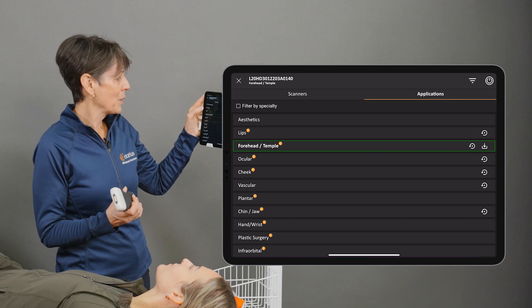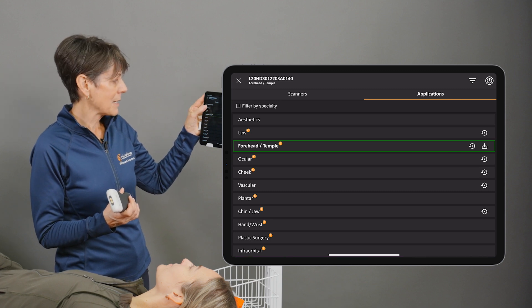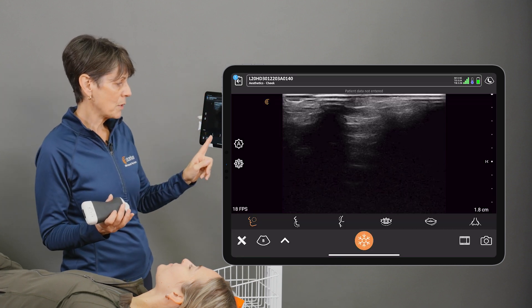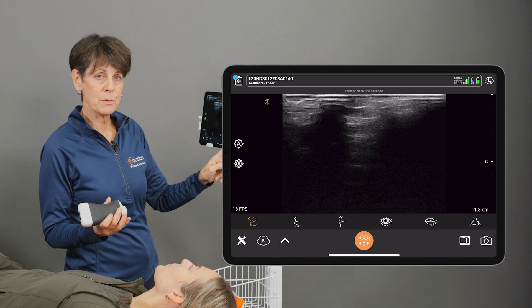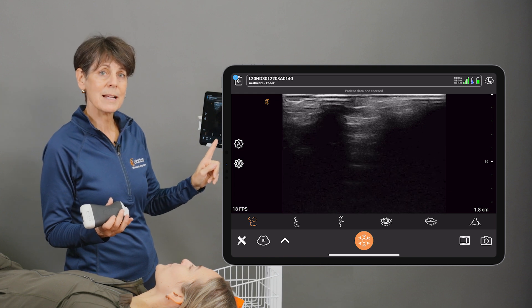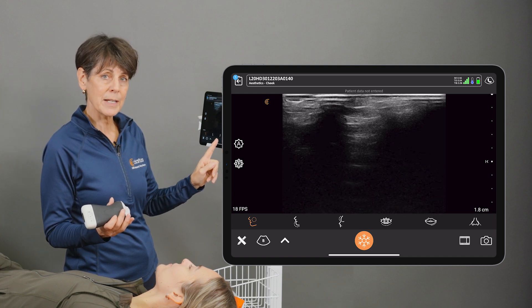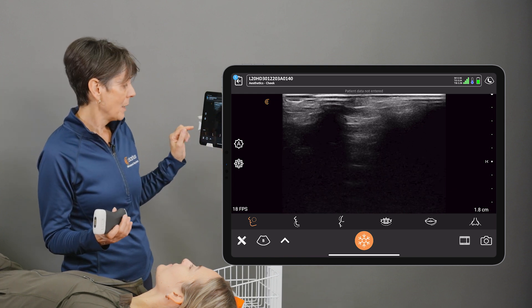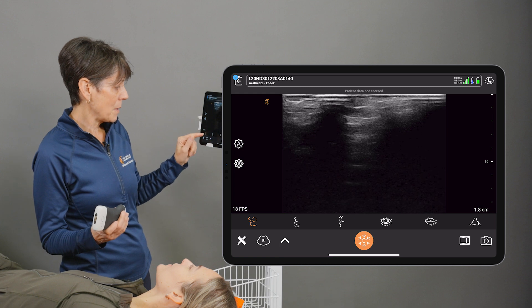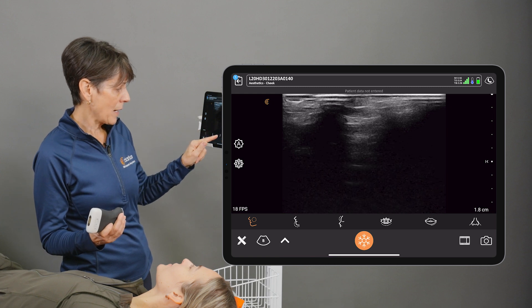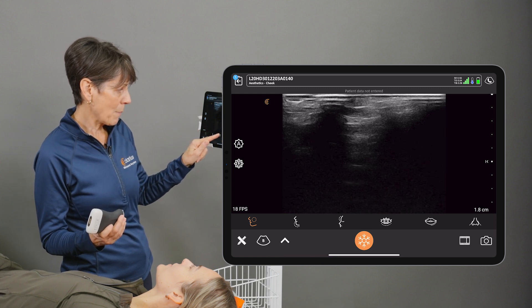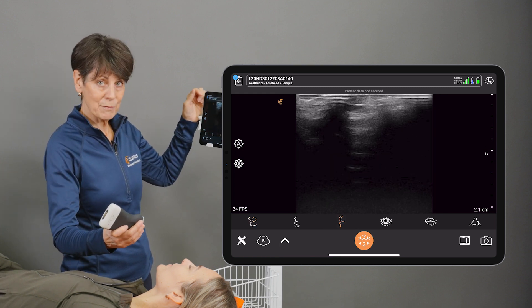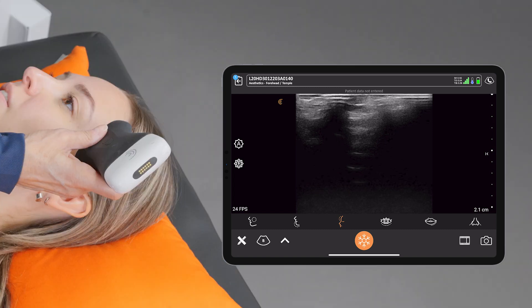However, now we have the aesthetics preset, and that gives you the option to switch presets on the fly. You'll see a whole bunch of little icons down at the bottom. If I want to image the forehead, I'm just going to tap on the forehead icon, and this is going to give me the forehead temple preset.